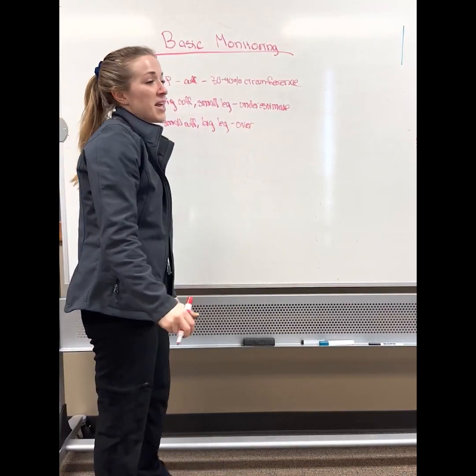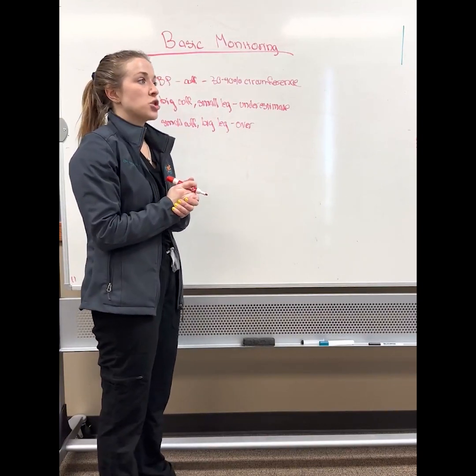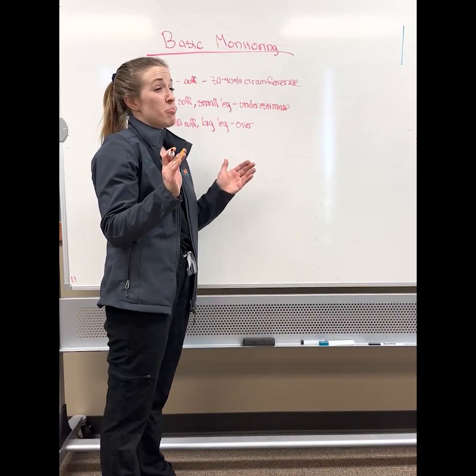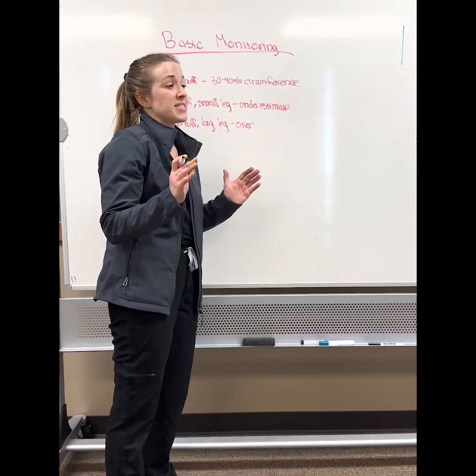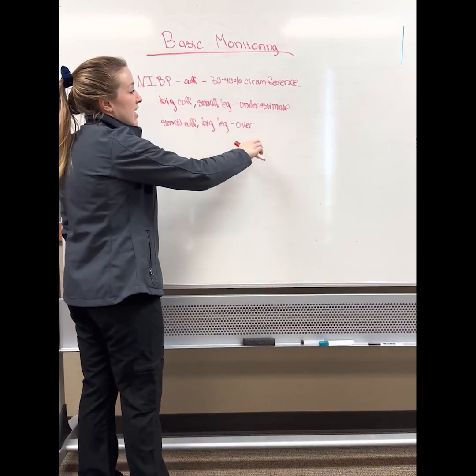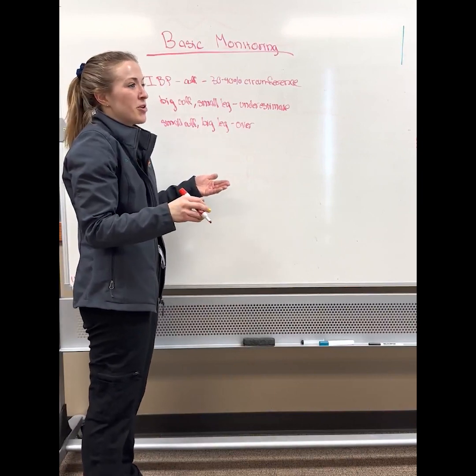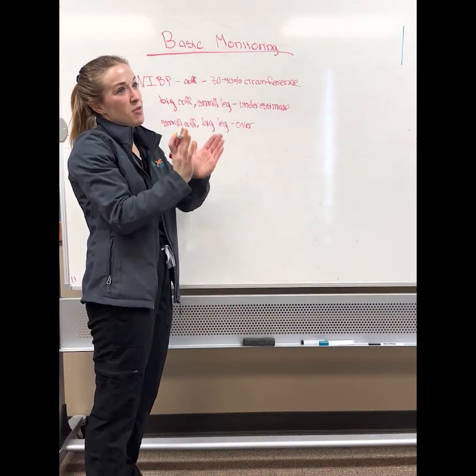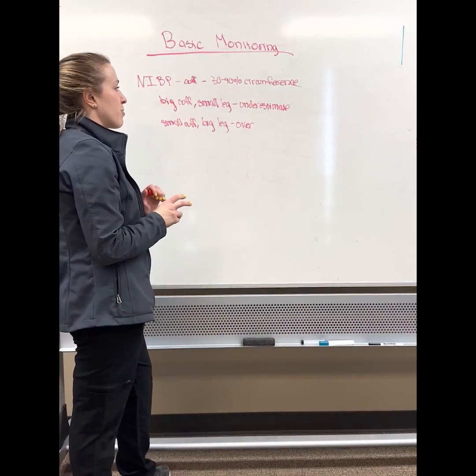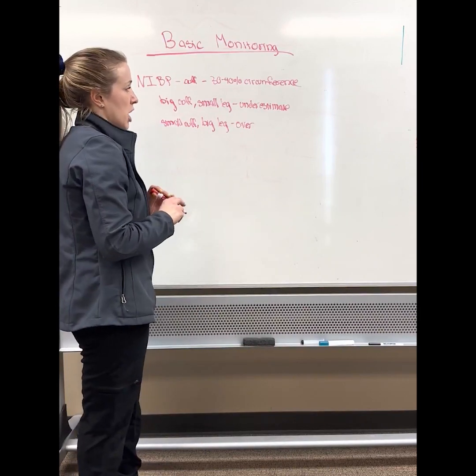So this is a problem we have in animals that have wedge-shaped limbs, like our chondrodysplastic breeds, like French bulldogs, corgis, dachshunds. When the leg is like a fat little sausage and you have to put on a really big cuff to fit it, sometimes the cuff will slide down the leg and it doesn't fit very well. So big cuff on a small leg, it might underestimate the blood pressure. But if you pick a small cuff that might fit a bit better, but it doesn't really reflect the size of the patient's limb circumference, then you tend to overestimate it. So those are one of the pitfalls of that particular type of equipment, and there are ways to get around that, and one of them is invasive blood pressure, which I'll talk about in a moment.